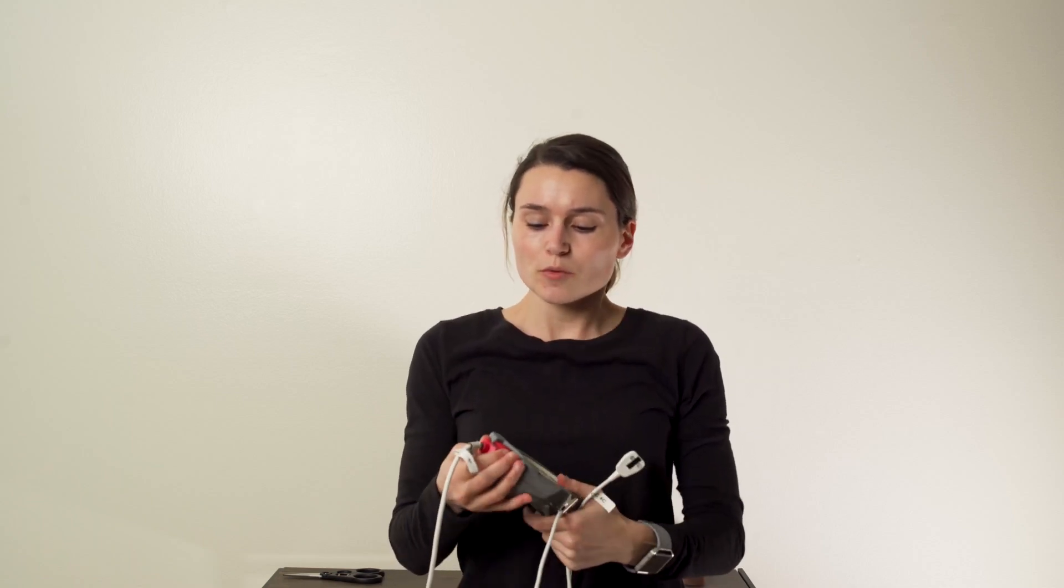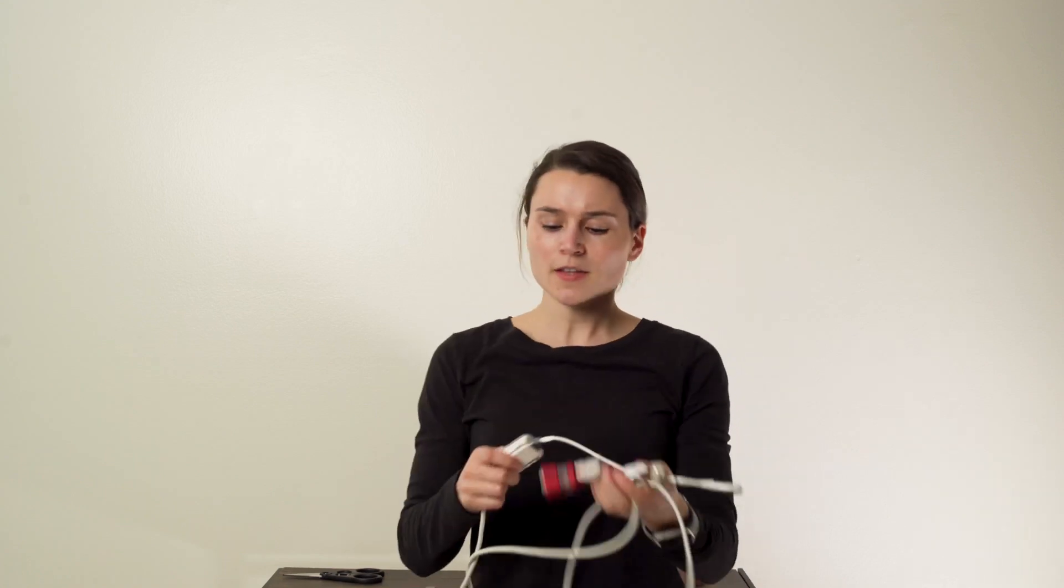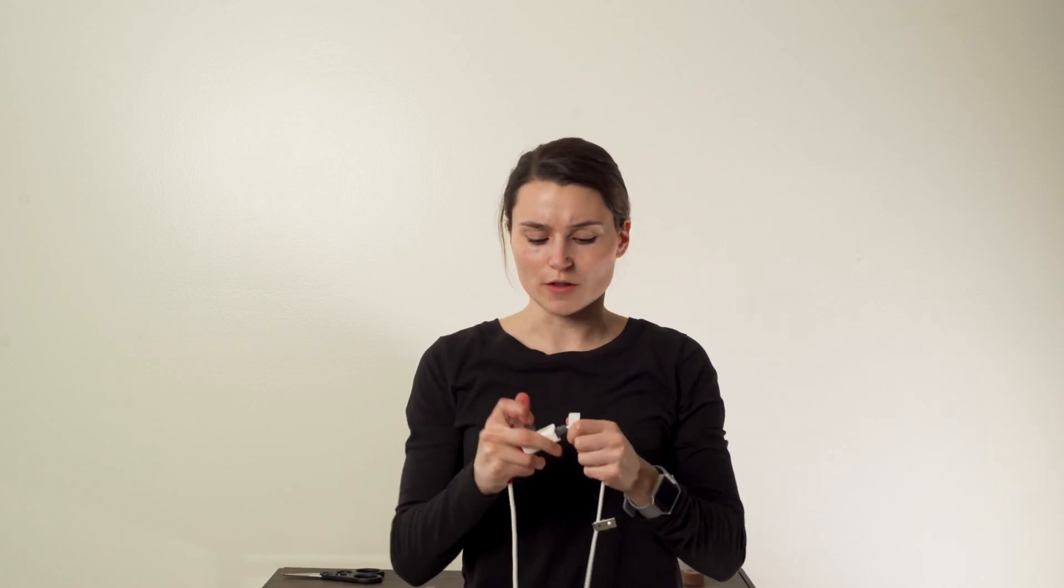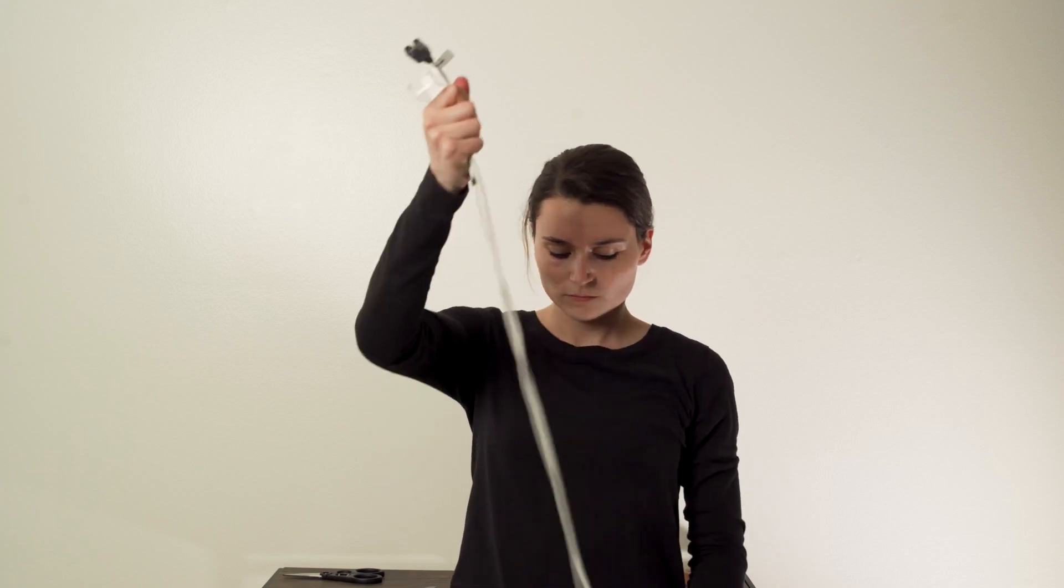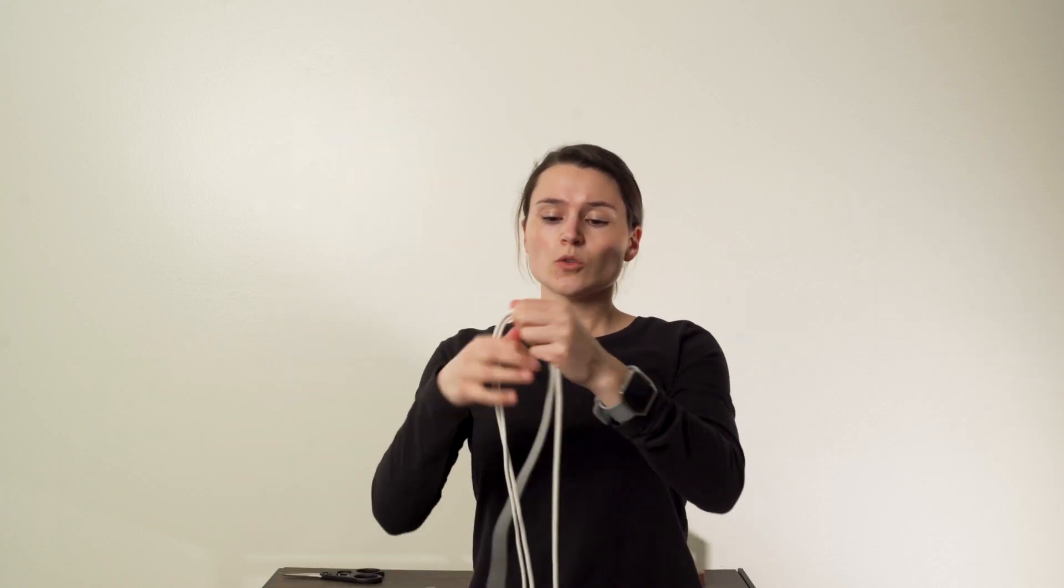For storage, remove the cord from the pulse oximeter, then detach the two cords from one another. Store the cords on a hook, on the wall, or in a cabinet.